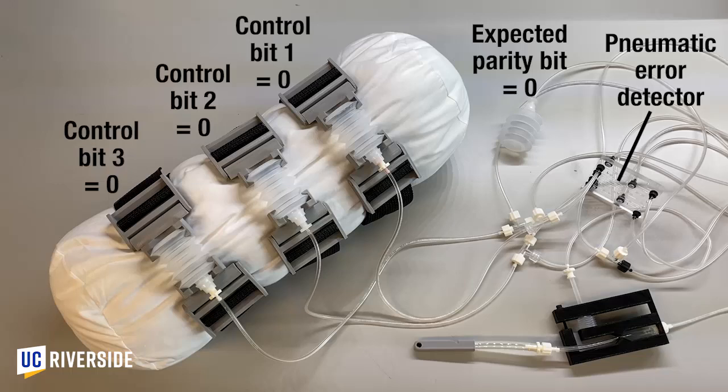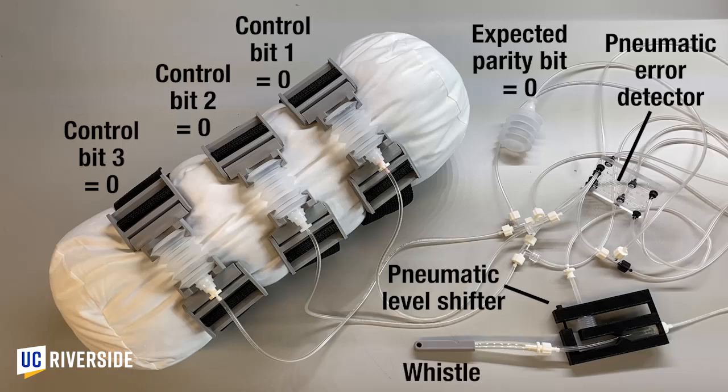The pneumatic error detector's output can be used for a wide range of different purposes. In this example, we've connected the error output to a black 3D printed pneumatic level shifter we developed that converts the error vacuum to a positive pressure. This pressure output is in turn connected to a gray 3D printed whistle that will alert the user of a problem with the IPC device.